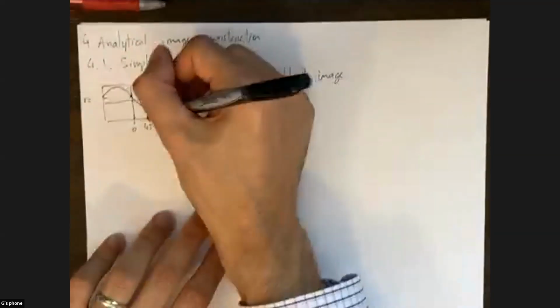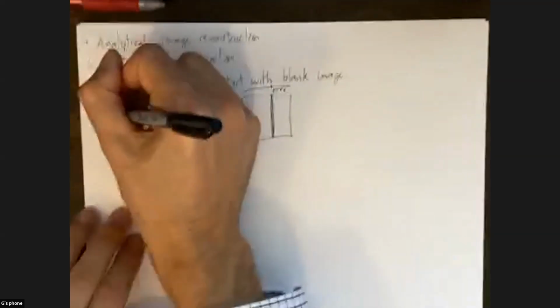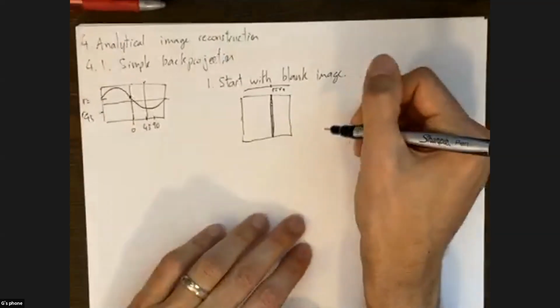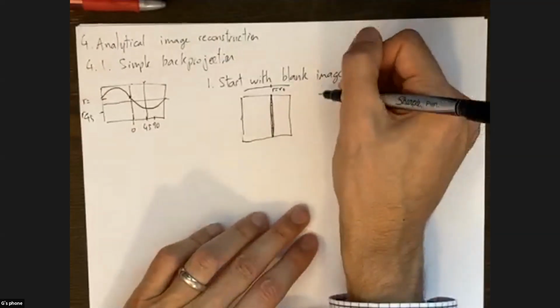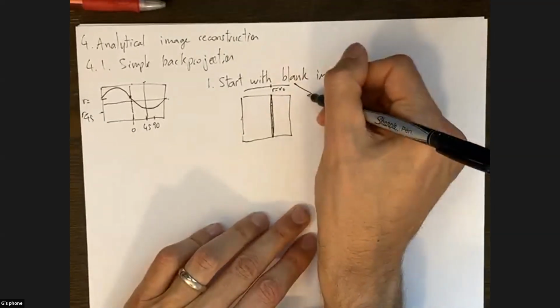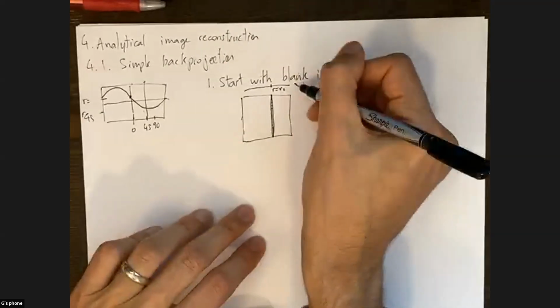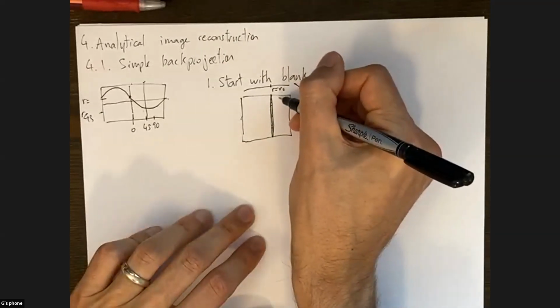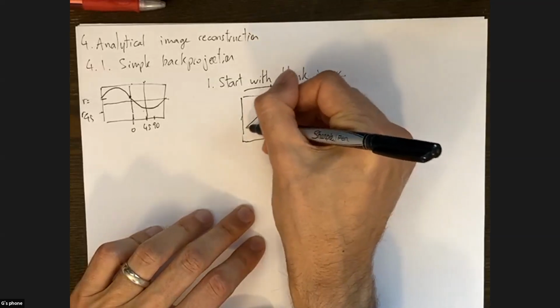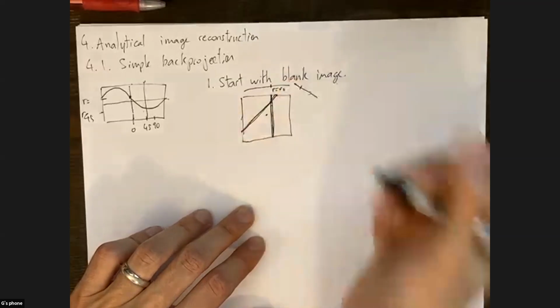So we can look at the 45-degree data here again. So now, this is our R45. Looking at the 45-degree, which would be here, basically we're saying it's somewhere here, right? It's a negative value. This is the center of the image. Now we're going to smear it again, but at an angle. So now the counts are going to be smeared here.